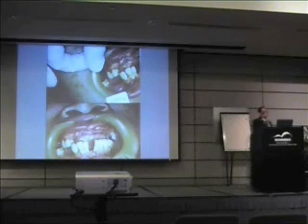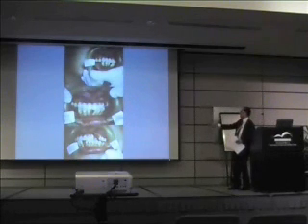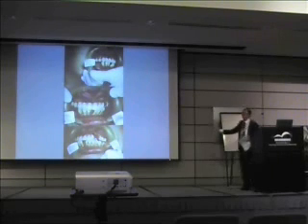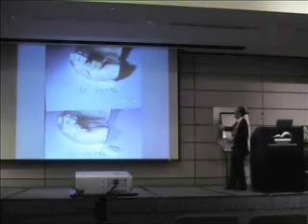What do we do? First and foremost, when we put an old denture inside, the old denture was all sticking out because of shrinkage, healing taking place and all that, and it was really a badly fitting denture. And that's the area that was extracted, so last time she had a tooth there. So the old denture has got to be discarded. We wait for a new denture, and this is what I want to tell you on the posterior area.